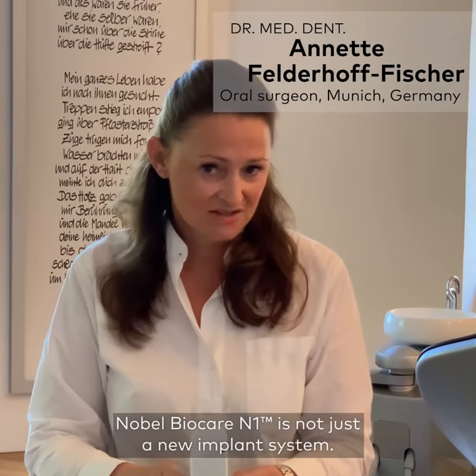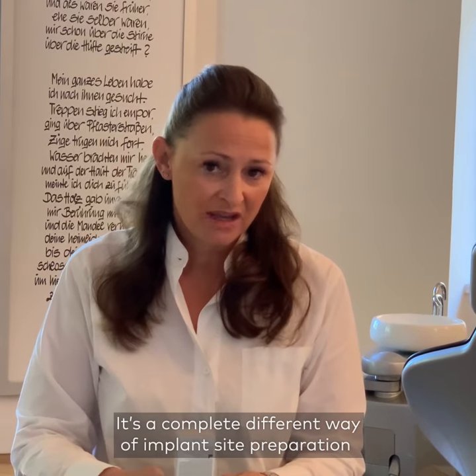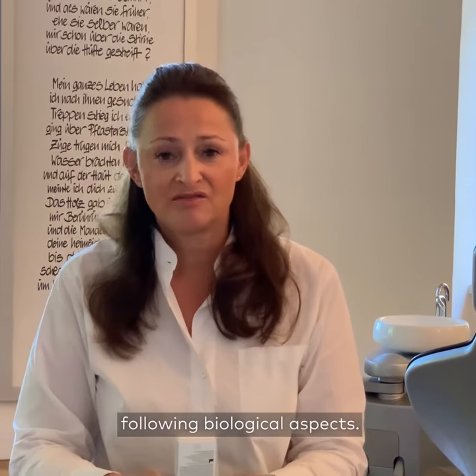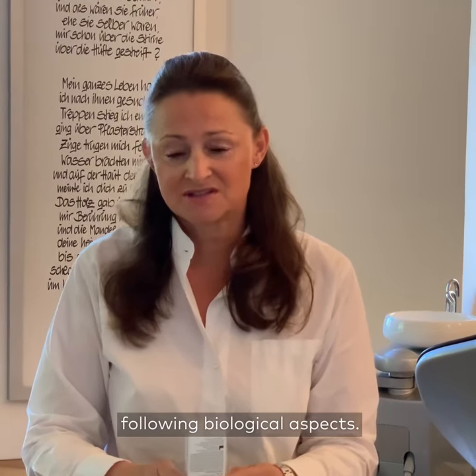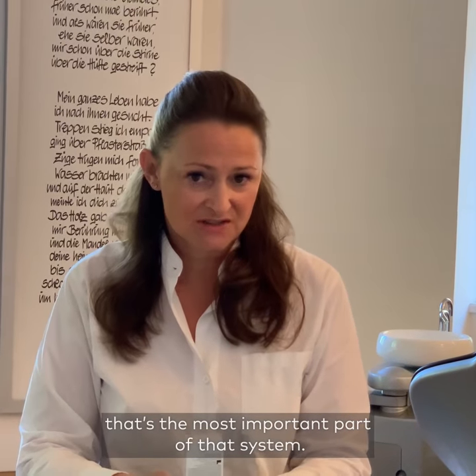The N1 is not just an implant system. It's a completely different way of implant site preparation, following biological aspects. And for me as a surgeon, that's the most important part of that system.